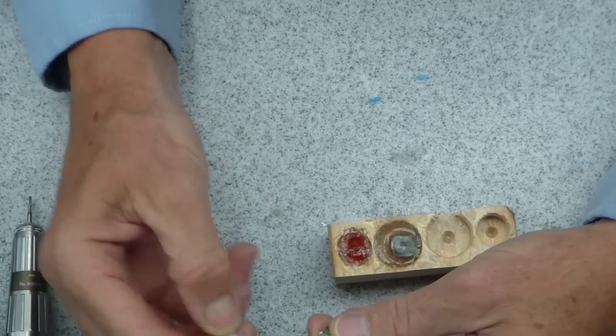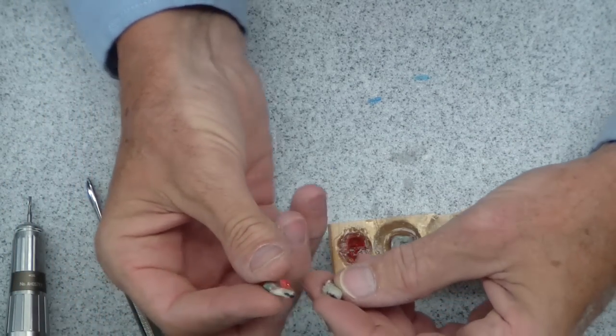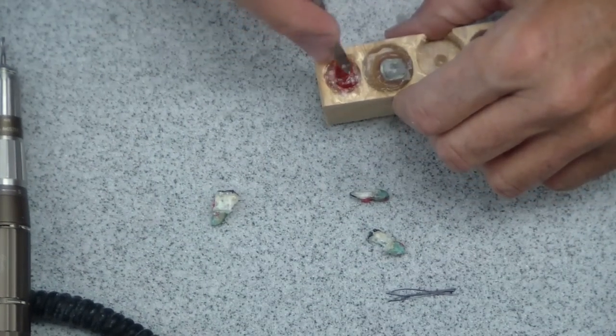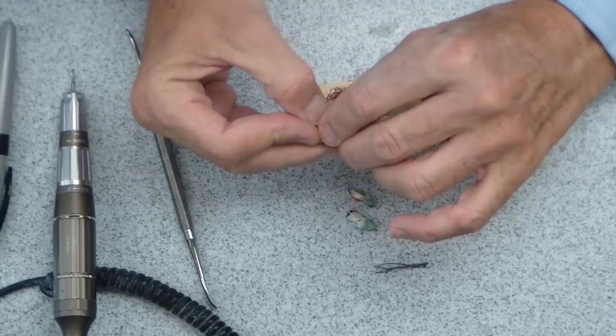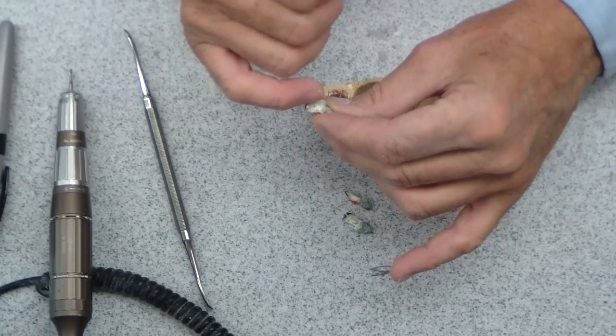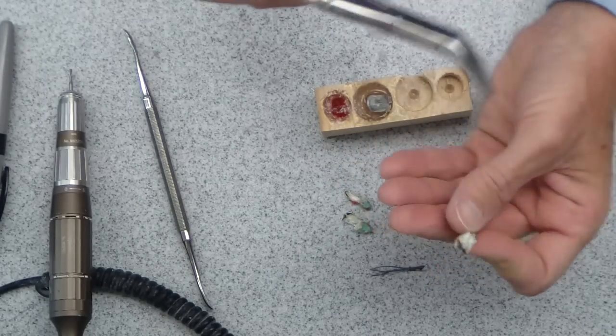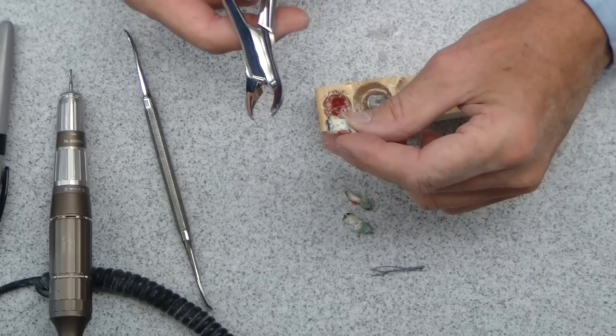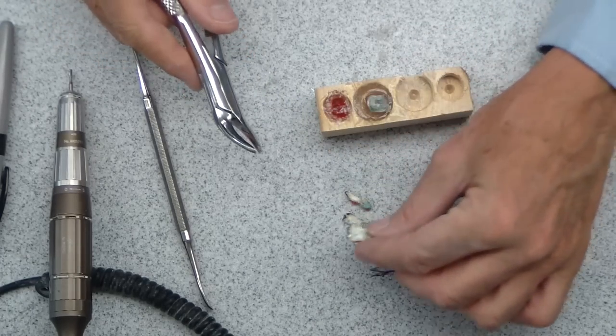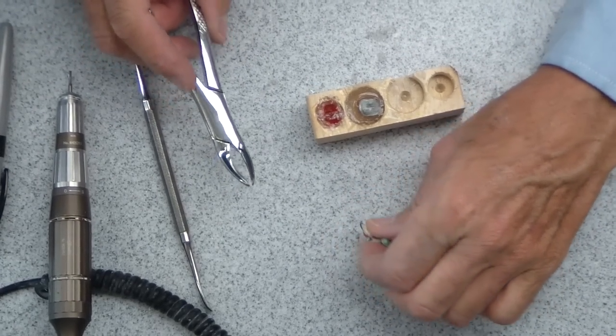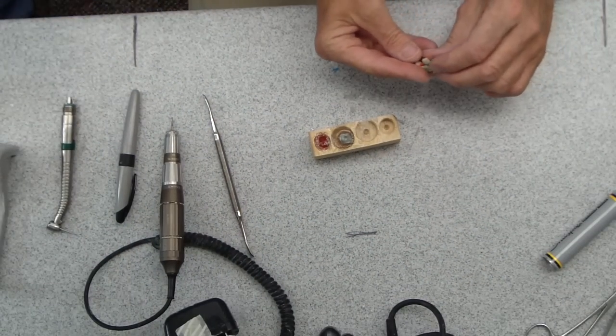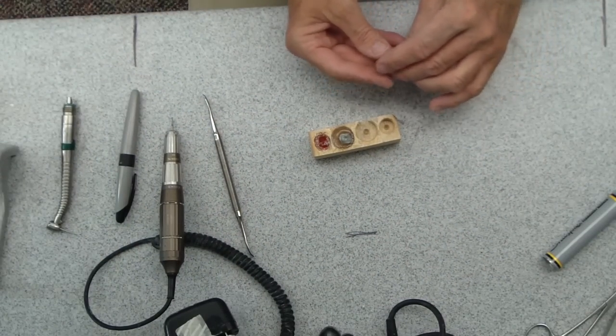Now, when you've done that, you can see the whole palatal surface, the palatal and the facial surface of the palatal root there. And so again, it's a pretty easy thing to get down to that number 6-9, just grab that guy. I wish they were that easy in the mouth, but that's the way you do it. It came out, as you see, the two buccal pieces came out separately and the crown's intact. I didn't have to go around digging out root tips. And when you take the two buccal halves out, the palatal one is pretty well exposed. You can get down on that pretty easily with your number 6-9 forceps. You can give it a little rotation, a little twisting back, and it usually works pretty well. Not all 100% of the time, but it's a different technique. Try that, see how it works in your hands, and hopefully it will be a big benefit for you.